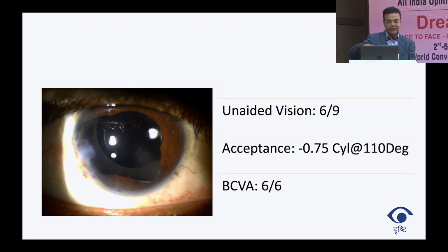You know, they're doing a good job. I have my oldest aniridia rings, now 15, 16 years old, and they're holding on. We haven't had much pigment loss yet.